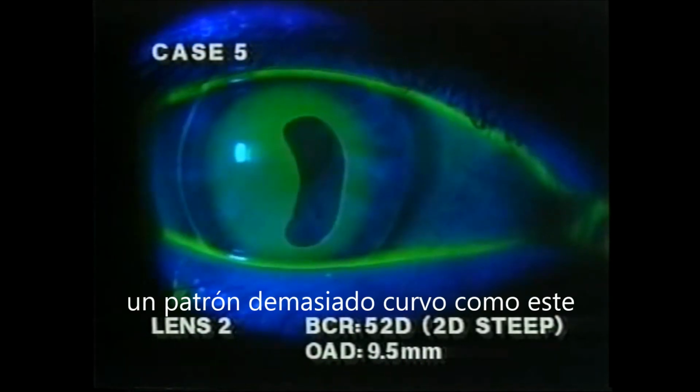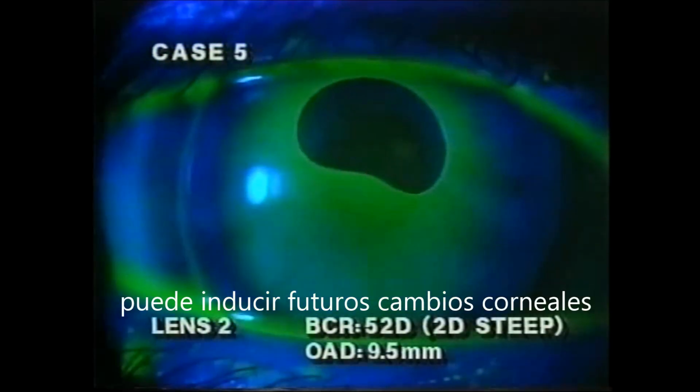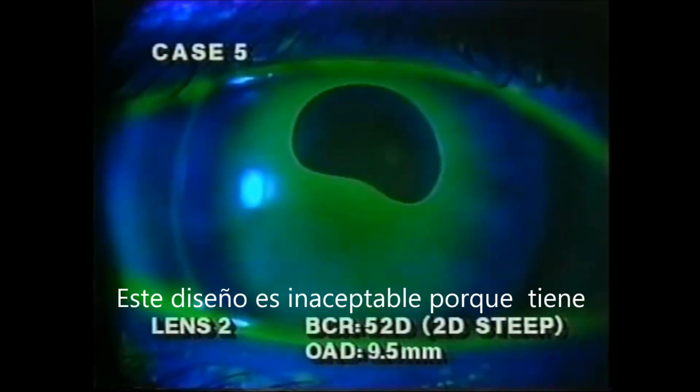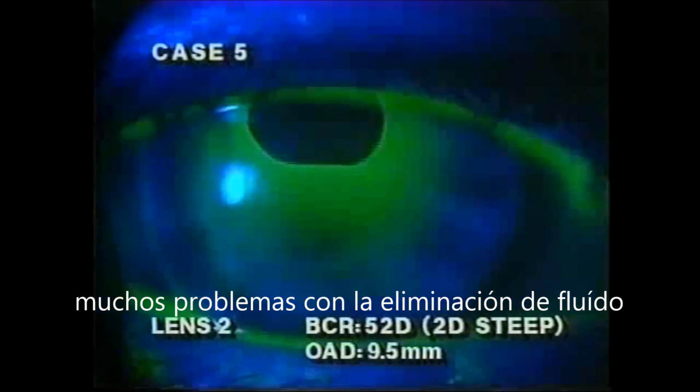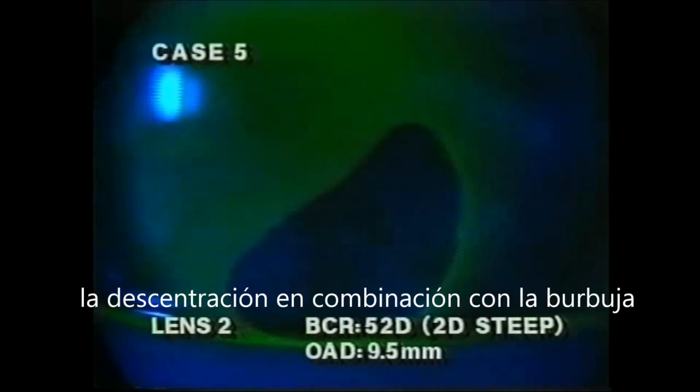A steep pattern emerges with mid-peripheral and peripheral bearing, creating a seal-off from tear exchange. This design would be unacceptable due to the problems of limited tear flow and the possibility of adherence. Lens decentration in combination with the bubble, which remains in the visual axis, would compromise vision.